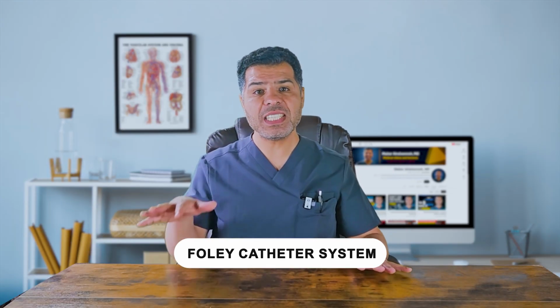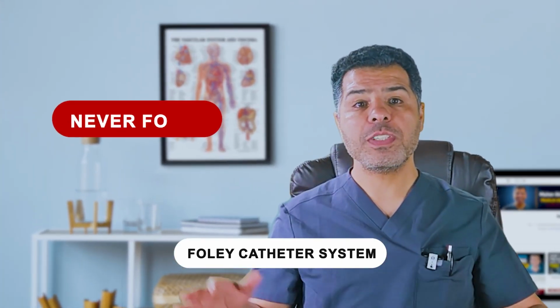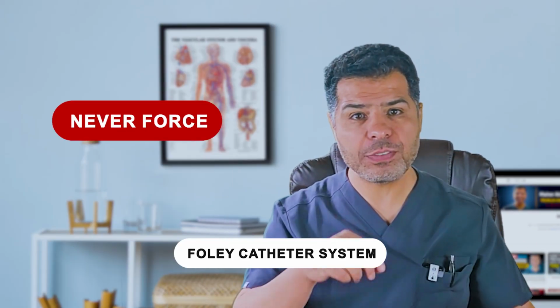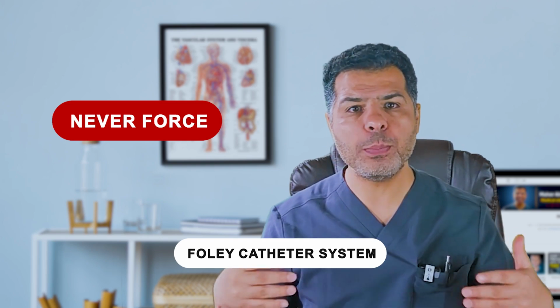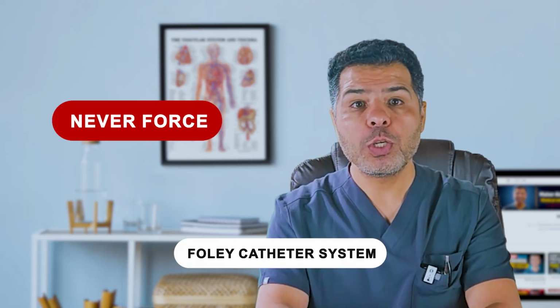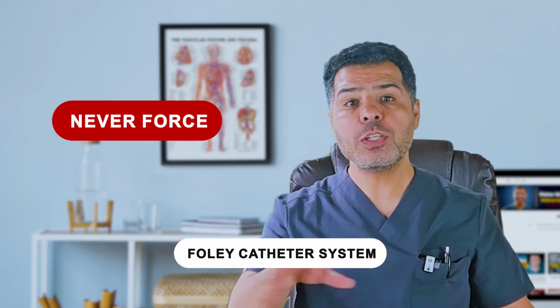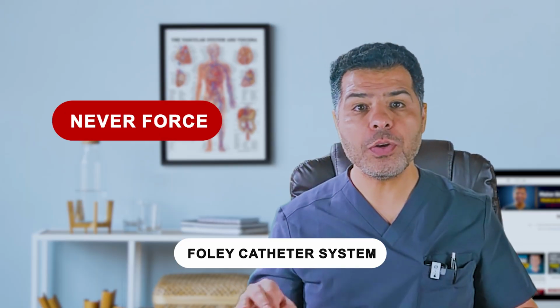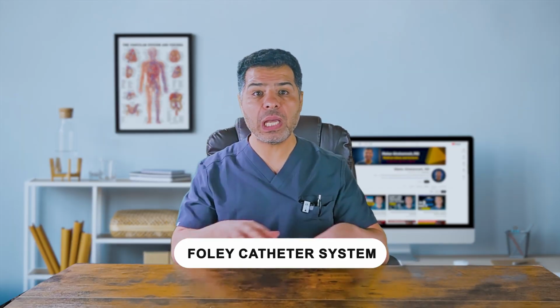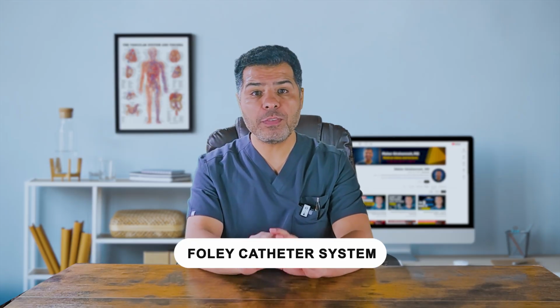I'm not going to discuss the insertion procedure itself in this video, but remember the following. Never force the catheter. Resistance in males is common at the external sphincter. Ask the patient to take deep breaths and bear down slightly. If you still meet resistance, stop. You might be dealing with urethral strictures, enlarged prostate, or false passage. Get urology involved here. You should see urine return before inflating the balloon. Remember that. If you do not see urine, do not inflate the balloon. You might be in the urethra, which can cause serious trauma if you inflate it in the urethra.